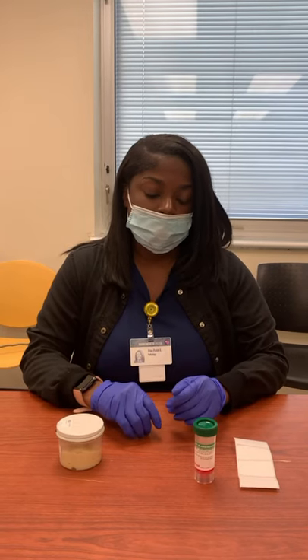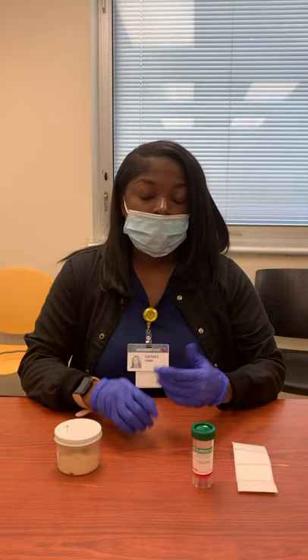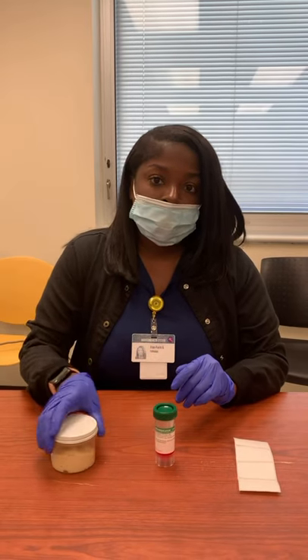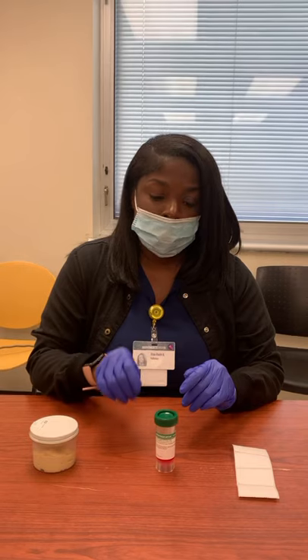As we all know, CLEA came around last year, and we just want to let nurses know that this is the way we will be accepting the stools from now on. We will no longer accept it in the sterile container — we have to transfer it over to the Carey Blair.